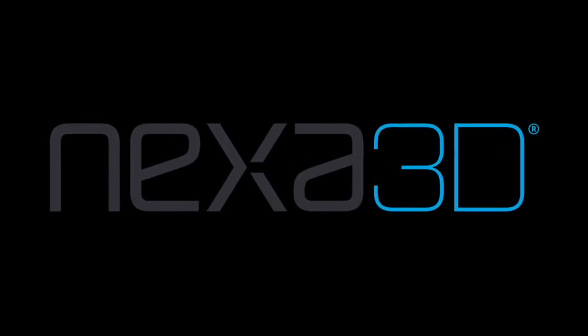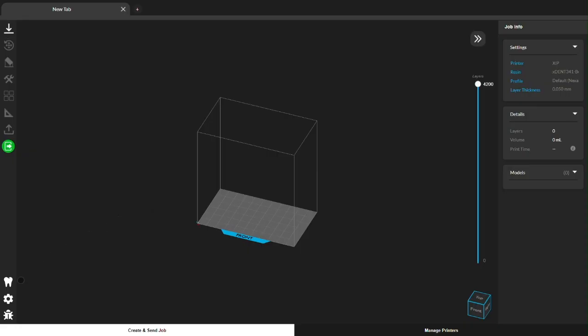Hey, Shea here from Nexa3D Support and I'm excited to give you a quick demo of our newest dental software, DentFlow.